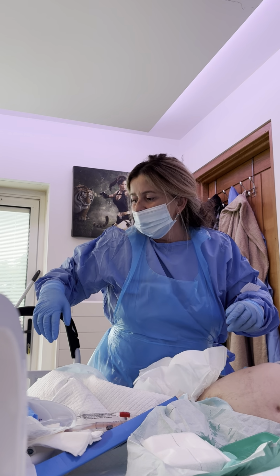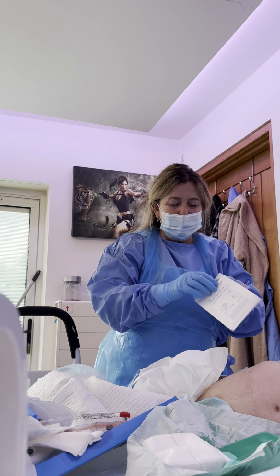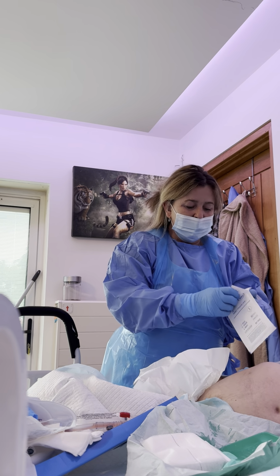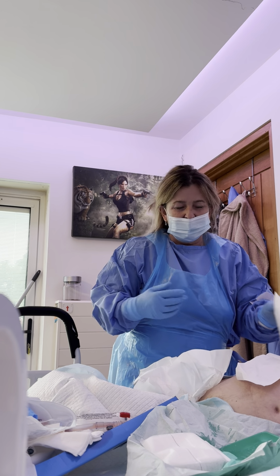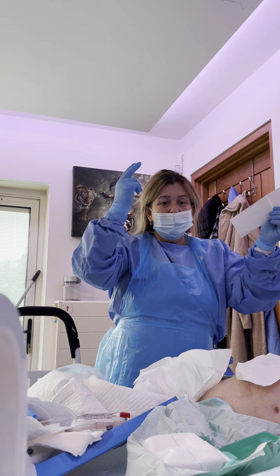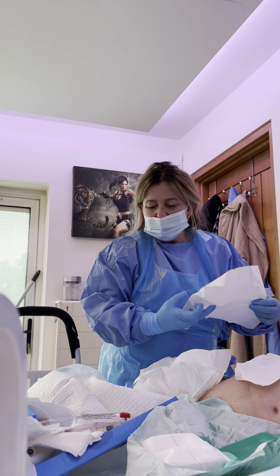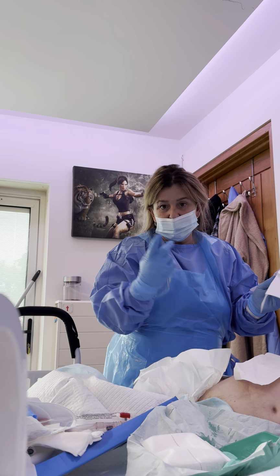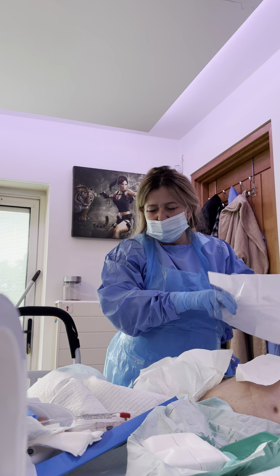So that's still going. So I always have plenty of gloves. Absolutely, always get millions of gloves. I've got a chance to double gown because obviously sometimes you get splashback with this. And it either goes up in the air that way or this way. So, yes, I do have a little bit of blood. I'll show you that in a second. But it's absolutely clear and peachy.